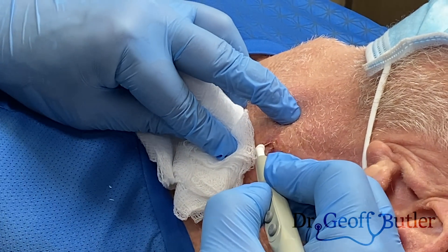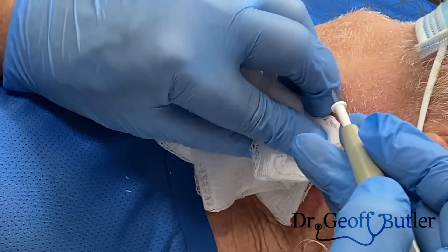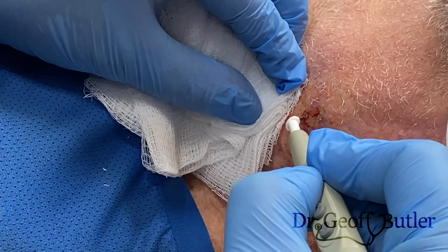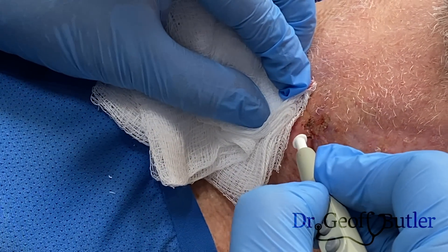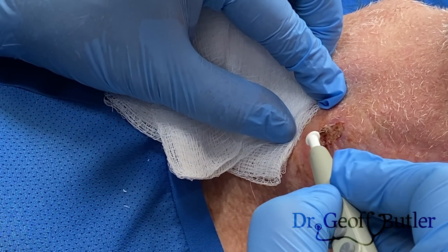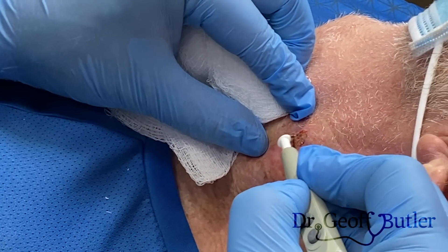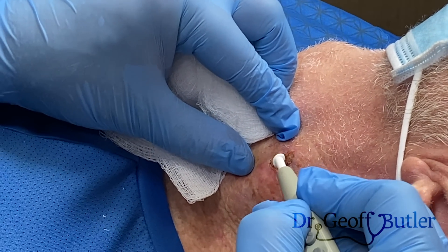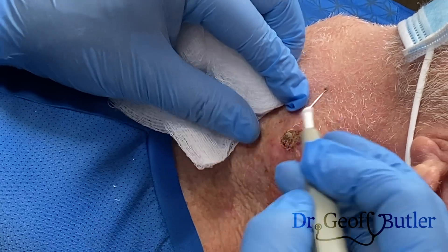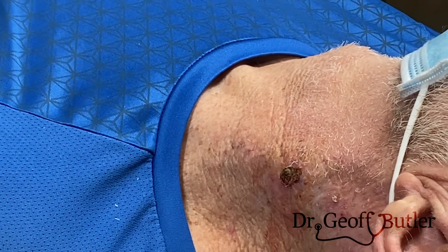You can see here this is a little bit friable. Up here that's relatively normal — we'd see when it kind of emulsifies. That's what we sometimes get with either viral tissue or dysplastic tissue — kind of eroding like that. I get an accumulation on the actual probe itself, so I'll just clean this up a little bit.